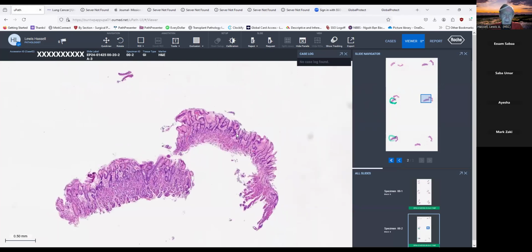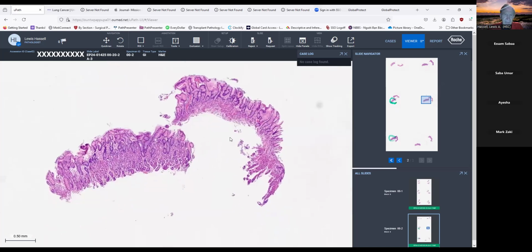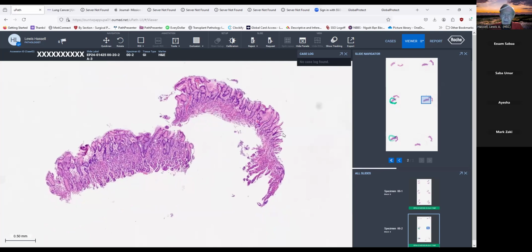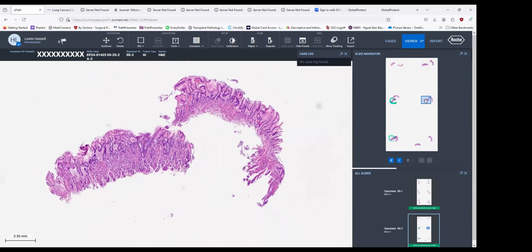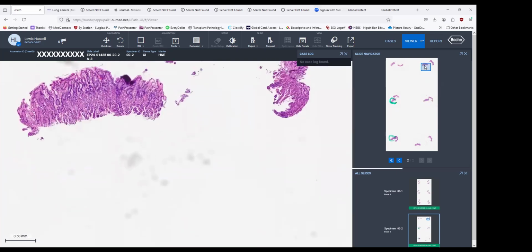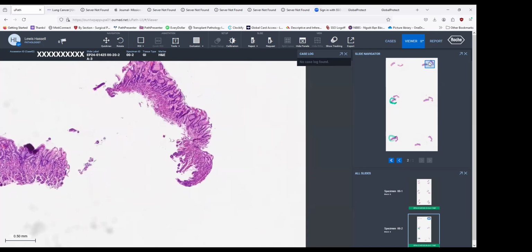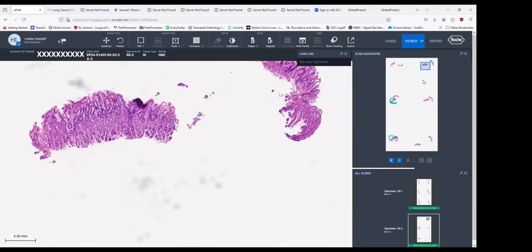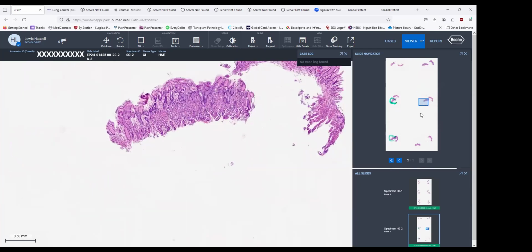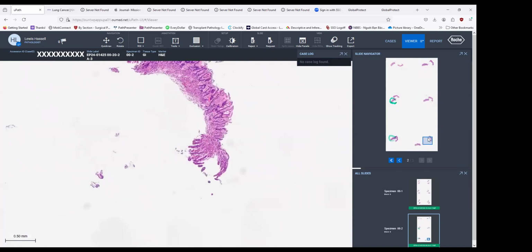At low magnification, I look at this biopsy and I didn't see too much that was of concern to me. So we looked at this level, and then we looked back here at this level. If I was just doing a very low magnification sign out, I might have made that the end of it. This set of levels sort of got separated a little bit here.